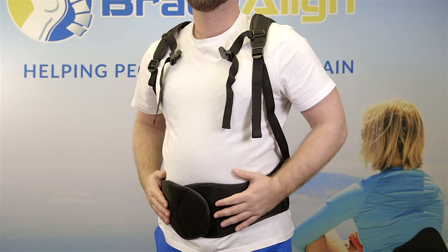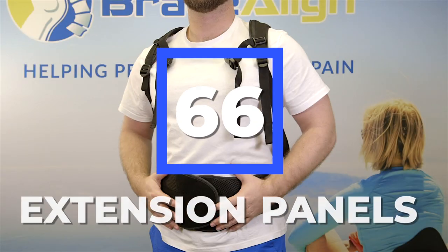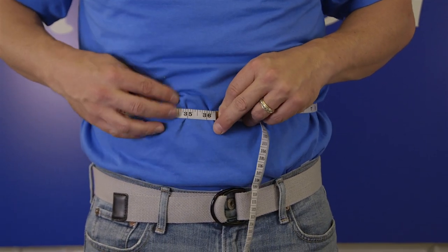The brace comes with an adjustable universal size, fitting waists 23 to 50 inches, and up to 66 inches with the use of extension panels. Each panel gives you an additional eight inches. Measure the circumference around your midsection at your belly button, compare this measurement to the size guide, and you are all set.